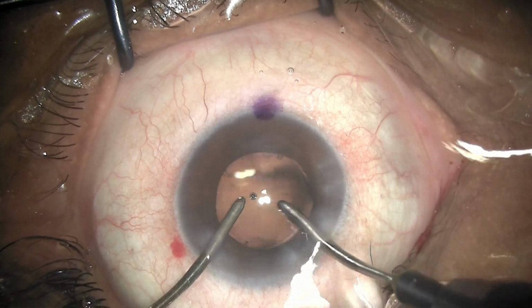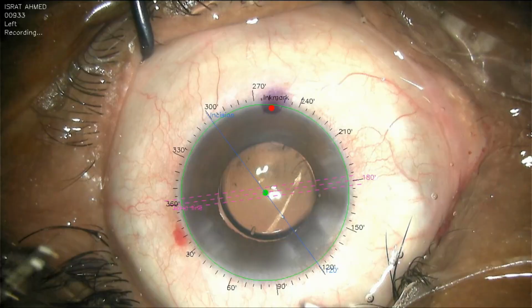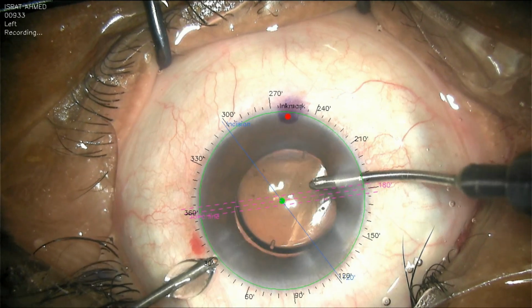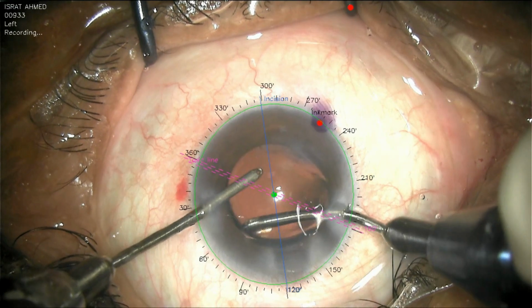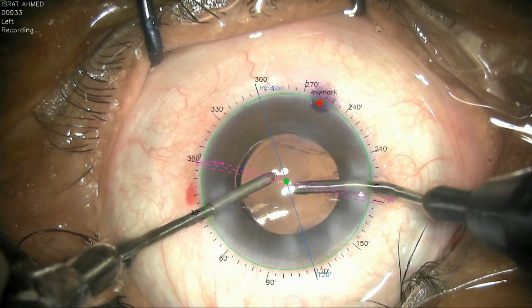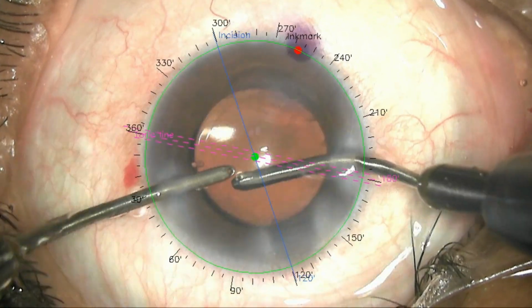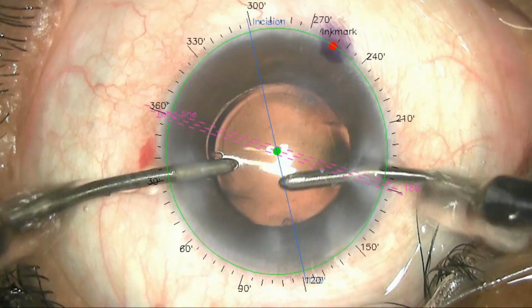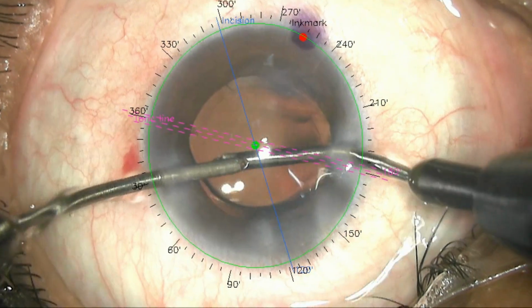Now once this part is done, I'm going to turn on the image guidance for Toric IOL placement. So this is what I am seeing on the monitor. I have shifted the HDMI from the normal recorder to the Precision software, and I'm seeing in the microscope and time to time taking my gaze onto the TV which is in front of me to do the guidance. And now I use the irrigation cannula to gently nudge the IOL into place.